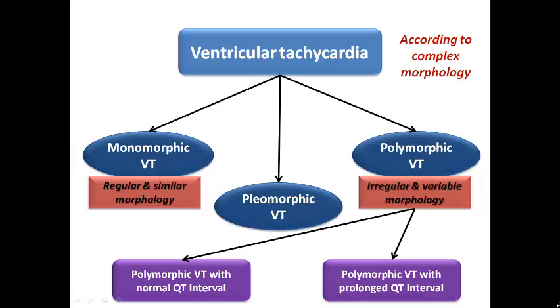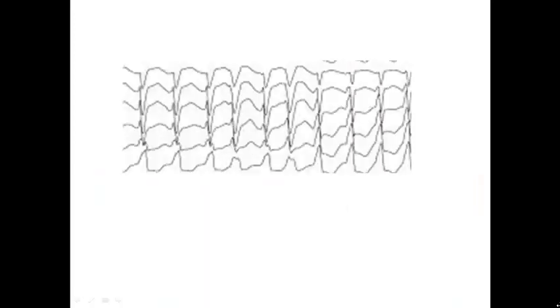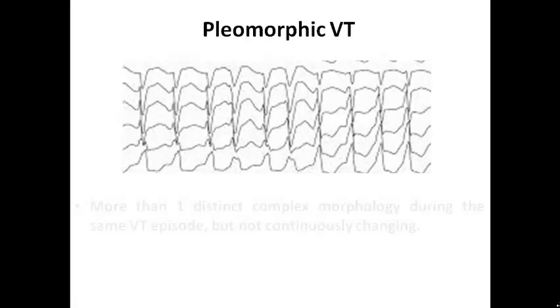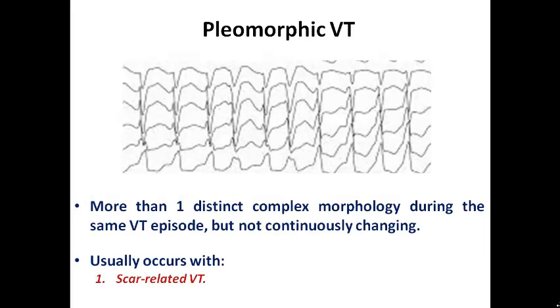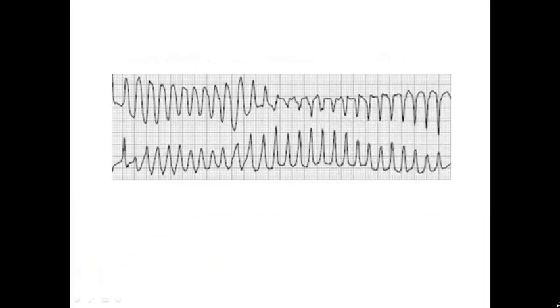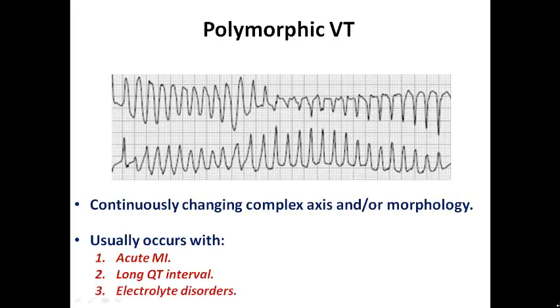For example, in this ECG we can see irregular wide complex tachycardia with at least 2 or 3 complex morphologies — this is pleomorphic VT, showing more than one distinct morphology during the same episode but not continuously changing, and it usually occurs with scar-related VT. In another example, there are multiple and continuously changing complex morphologies with changes in axis — this is polymorphic VT, which usually occurs with acute MI, long QT interval, and electrolyte disorders.